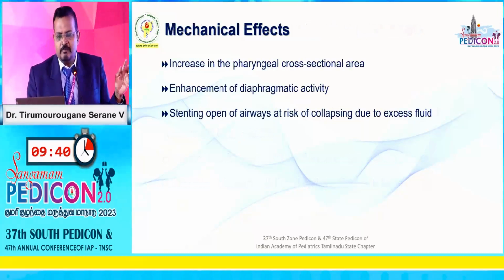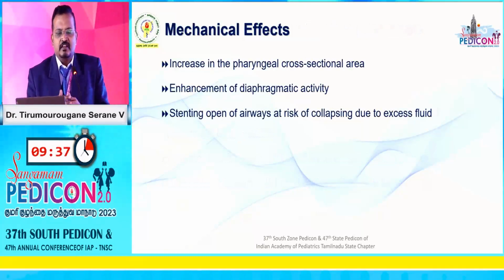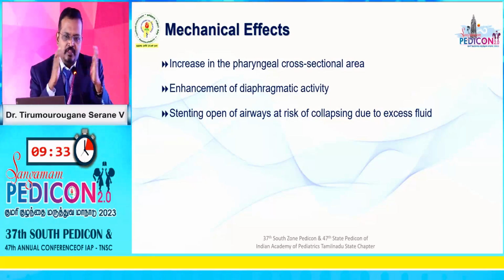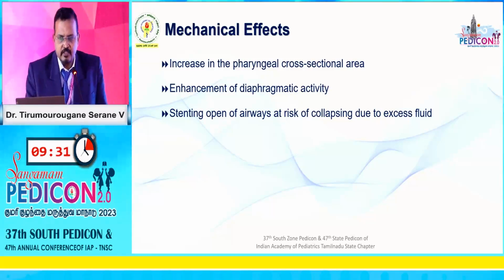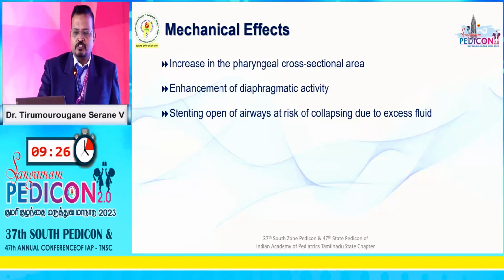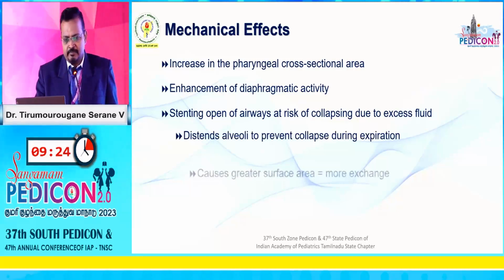Apart from that, there is a lot of mechanical effect. It increases the size, the diameter of the pharynx, so air can flow in a bit more easily when you give CPAP, and it also prevents the airway from collapsing.